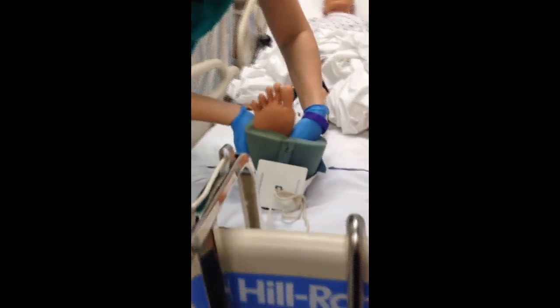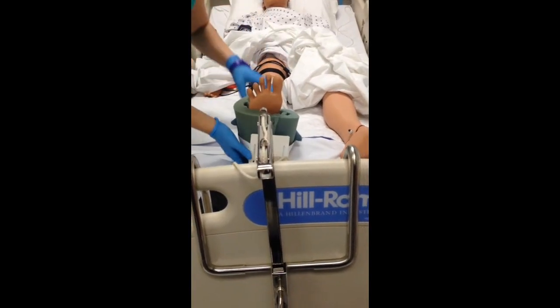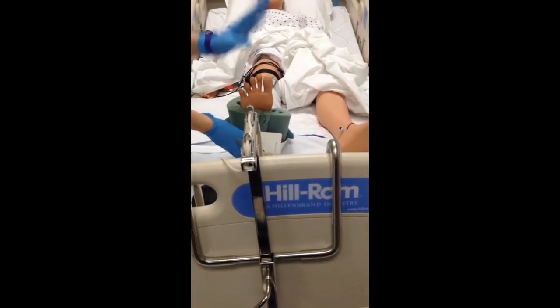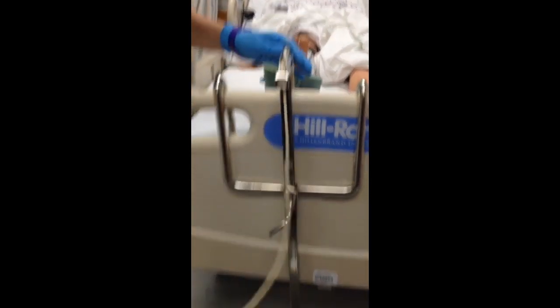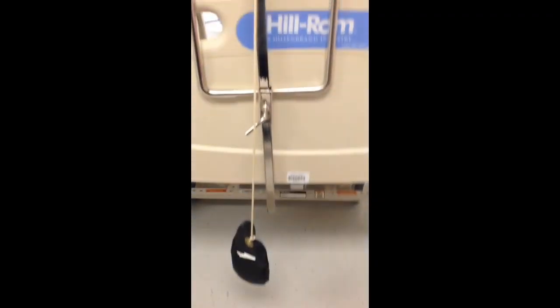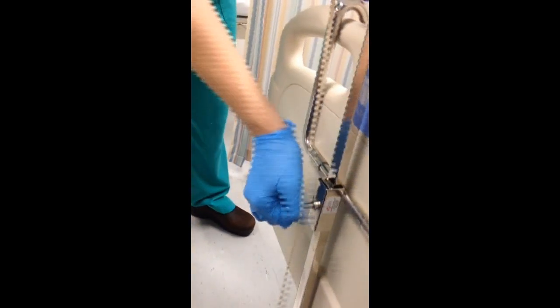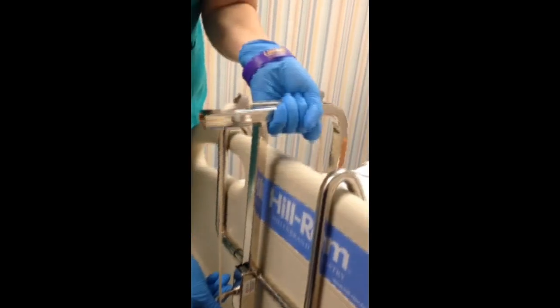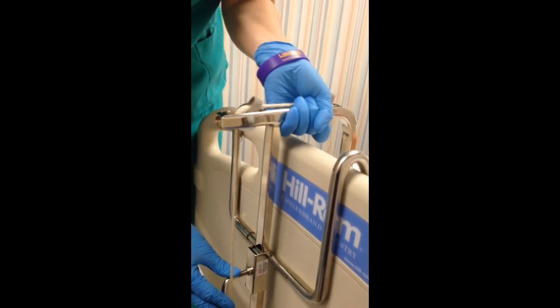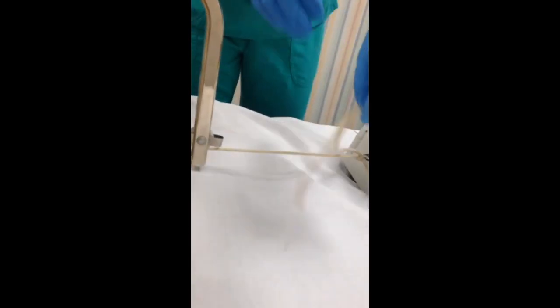Let's make sure that heel is up. The alignment is a 90-degree angle — just completely straight with the hip. Knee is facing towards the ceiling, toes are facing towards the ceiling. We're going to gently put the weight back down to get the traction back. Make sure that it's taut. We also want to make sure this rope is at a 90-degree angle — we can adjust it by loosening this and going up or down to adjust the angle. Everything needs to be 90 degrees, then we tighten it here. Make sure there's no knots.